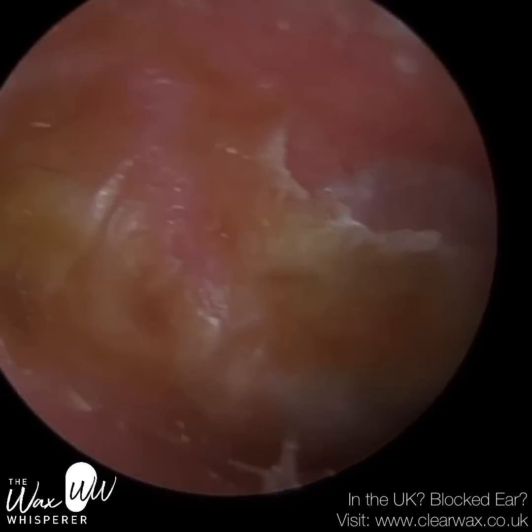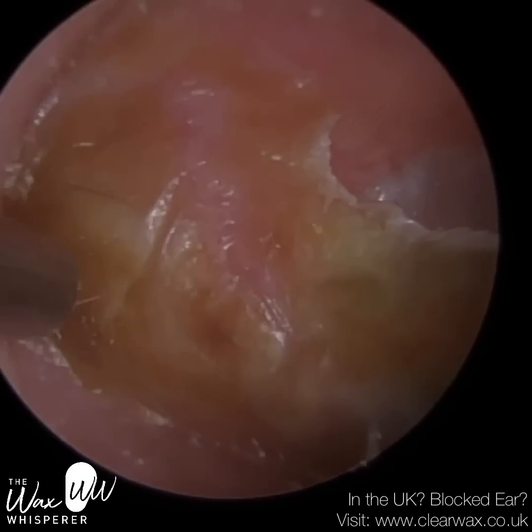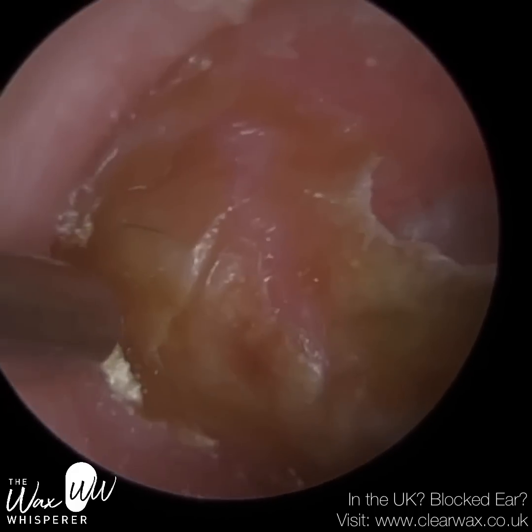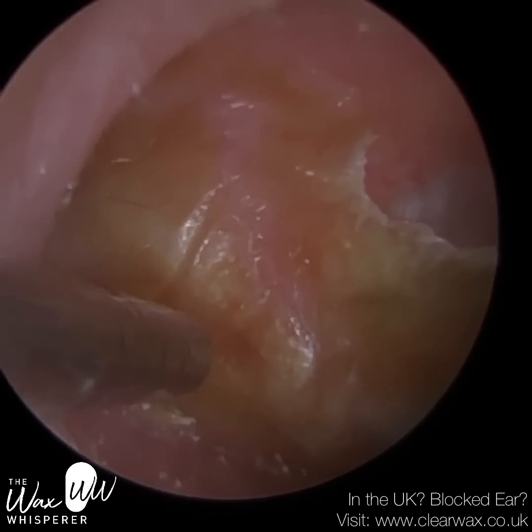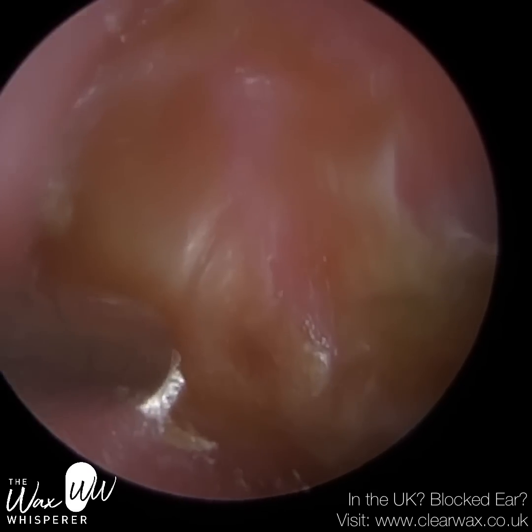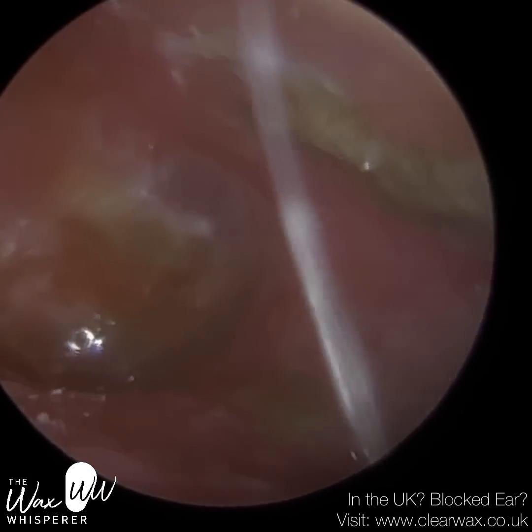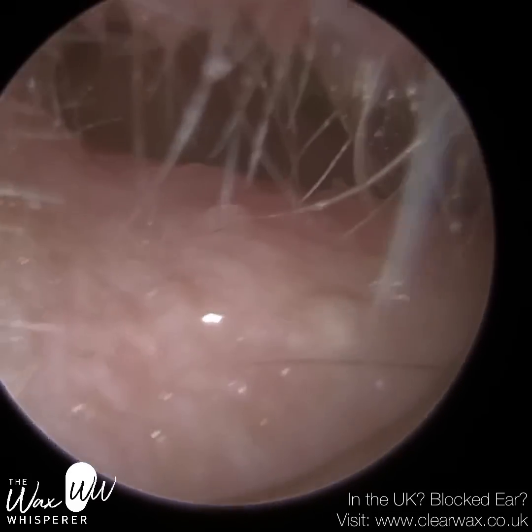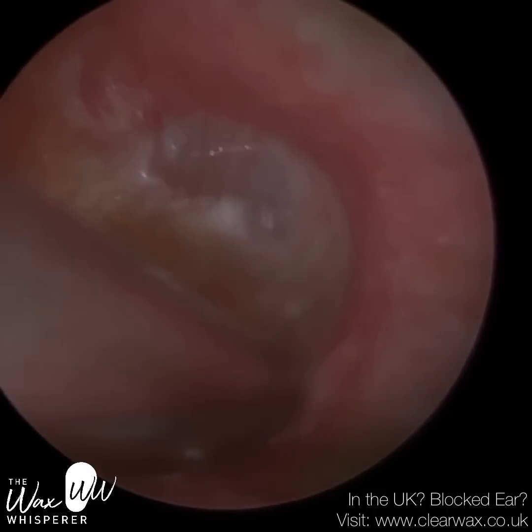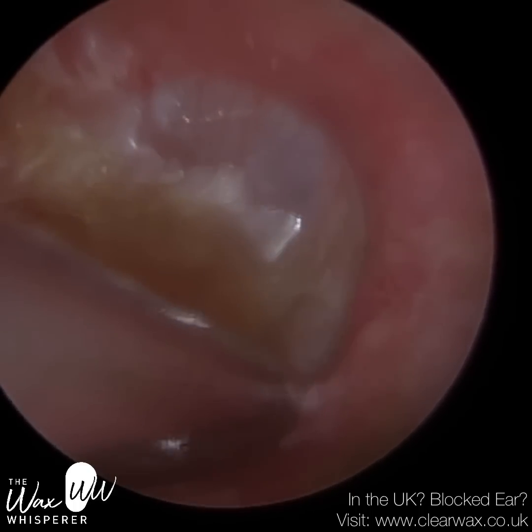We've still got skin in the inferior recess — there's a little trench, a little basin at the bottom of the eardrum — and now we're on the anterior recess, the front part. In the case of the left ear, there's a little alcove there, and skin can get trapped in that alcove and also in the inferior recess at the floor of the eardrum as the skin is migrating. I'm going to the roof of the ear canal because the skin extends all the way up there and is failing to migrate out. It's extremely stubborn and adhered. This skin is not going to come out by itself — it's already folded upon itself two, maybe even three times — and if I didn't remove it, it would just continue to grow, shed, fold upon itself, and potentially get infected.